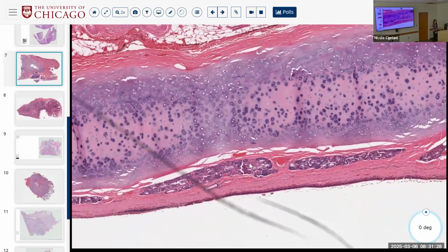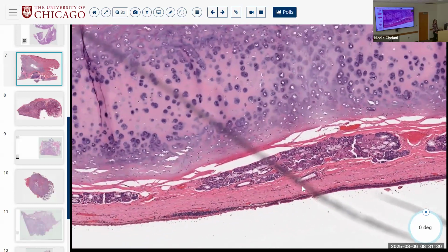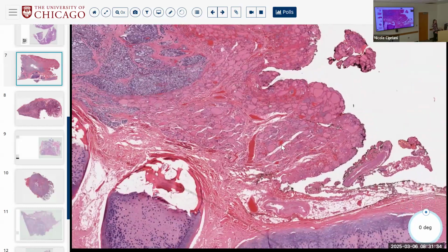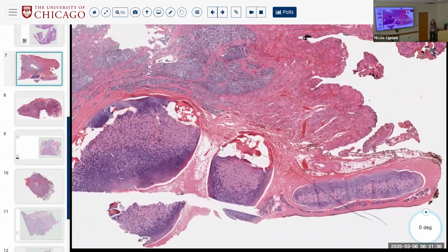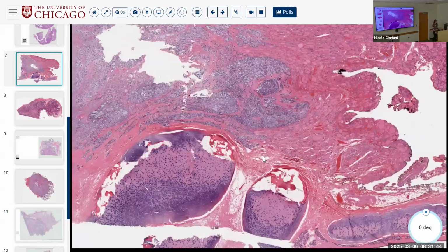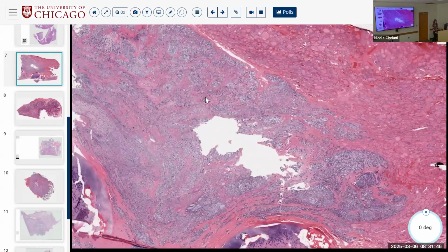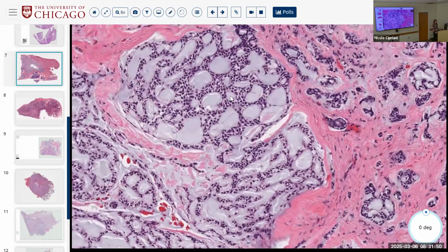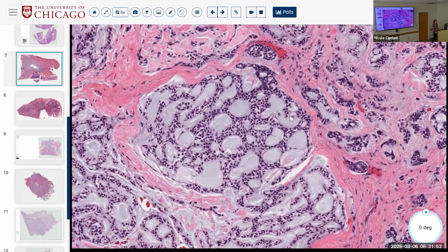Yeah, it looks like cartilage with respiratory glands and respiratory mucosa adjacent to thyroid. Yeah, so we're probably dealing with some larynx or tracheal cartilages, fine, that have become focally ossified. So then in the neighborhood, there's this infiltrative neoplasm with, give me one word for this morphology.